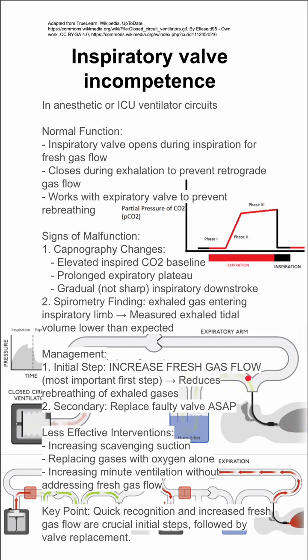Again, key point, quick recognition and increased fresh gas flow are crucial initial steps, and you always need to replace the valve for the definitive fix.